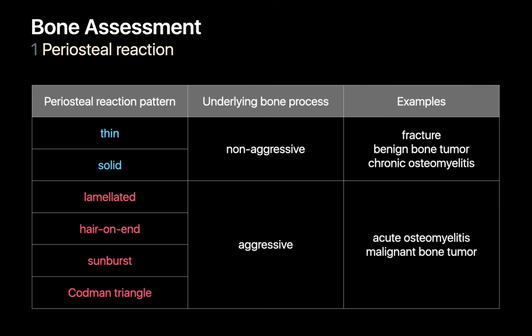When you notice the presence of periosteal reaction on a bone x-ray, it's an important hint that there's been some sort of cortical bone insult, and the periosteal reaction pattern may help suggest if the insult was non-aggressive, like a recent fracture, a benign bone lesion, or chronic osteomyelitis, or if the insult was aggressive, like acute osteomyelitis or a malignant bone tumor.